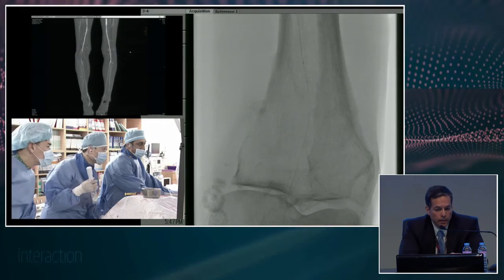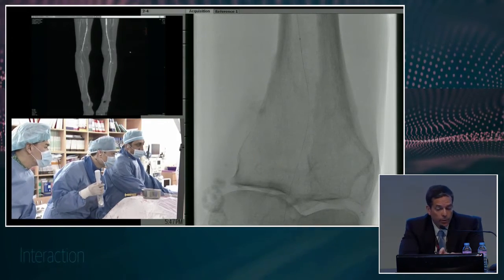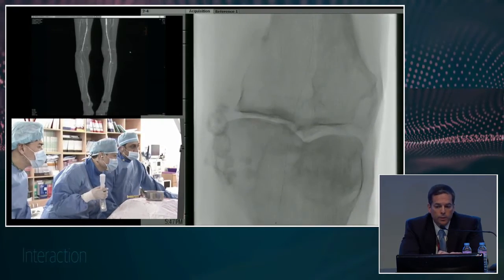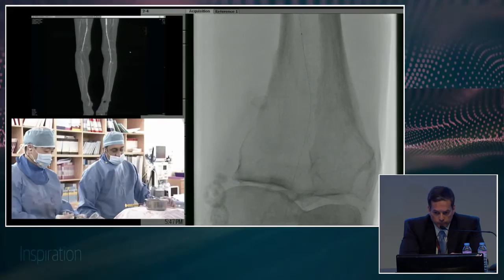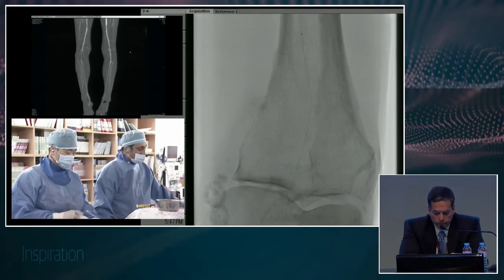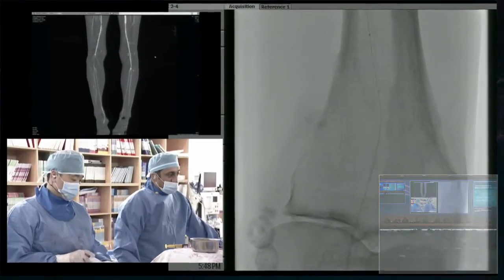And the Leipzig data on the popliteal segment is actually quite good now at 4 years. So that would be another alternative. Okay, all right, let's go here. Yes, the main reason I agree with you not to do that would be the size mismatch.